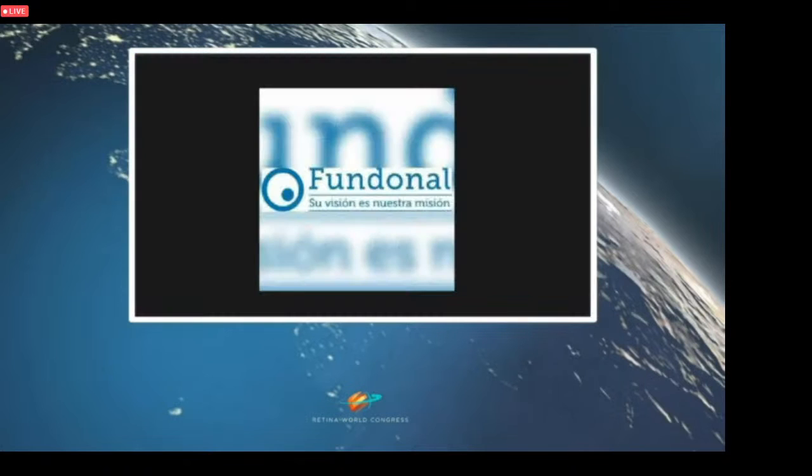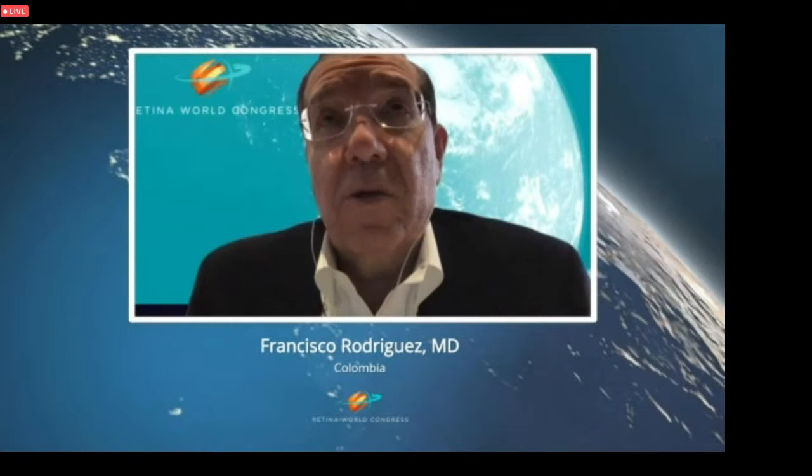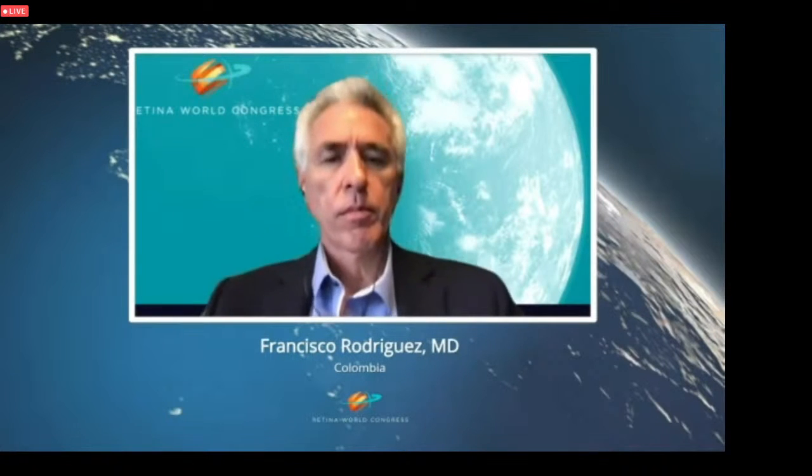Arturo, I like to always check in the OCT both quantitative and qualitative biomarkers. I like to check always the central retinal thickness, and also I like to check if there is an alteration in the retinal interface, the presence of DRIL and hyperreflective foci, and also the status of the external limiting membrane and the ellipsoid zone. And finally, I like to check the pattern of the macular edema, and if there is an associated serous detachment, as was mentioned by Dariana.